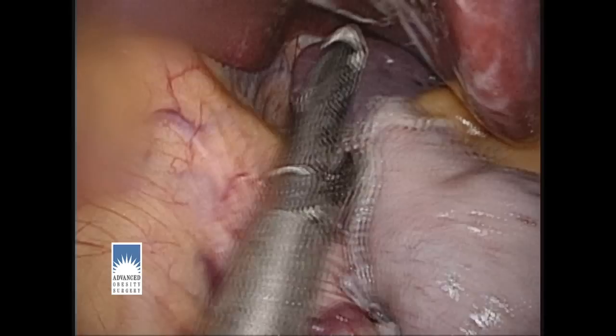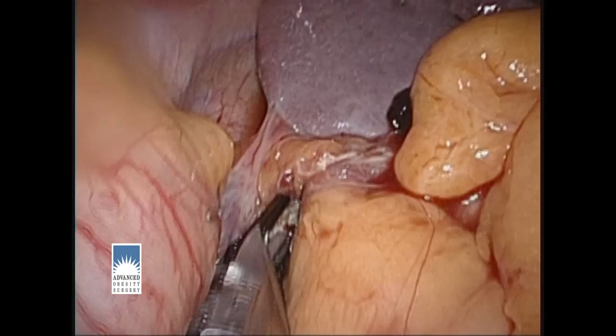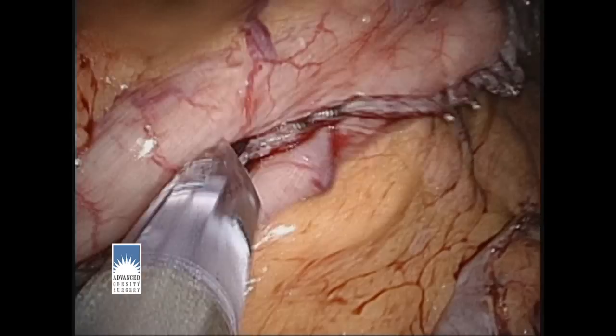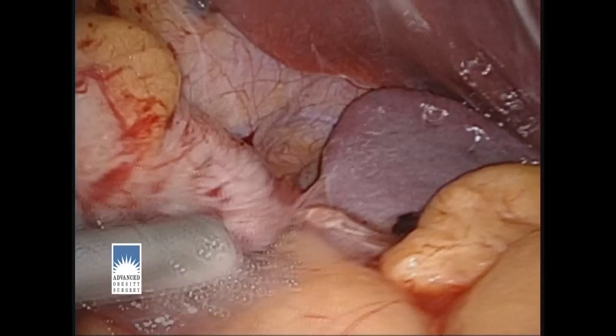Now that the resection is complete, we pull that portion of the stomach down out of the way and bring our clip applier up to the top, where we apply more clips for added security and control of oozing from the staple line. We do this all the way down the staple line for extra security. We then add a fibrin sealant — a fibrin glue that's like an epoxy — slathered all along the staple line for even more security.